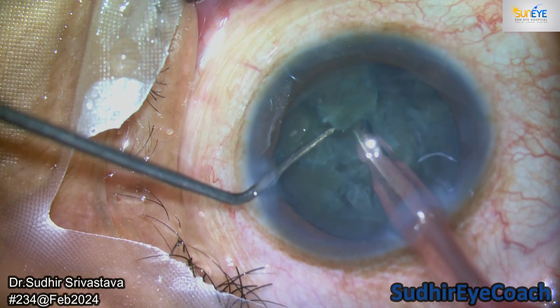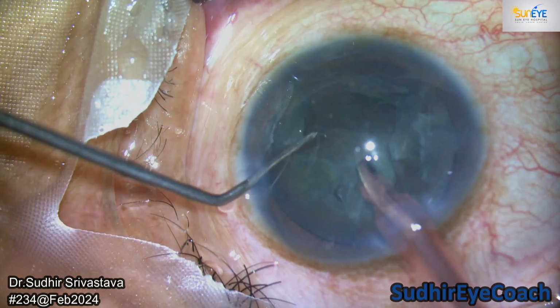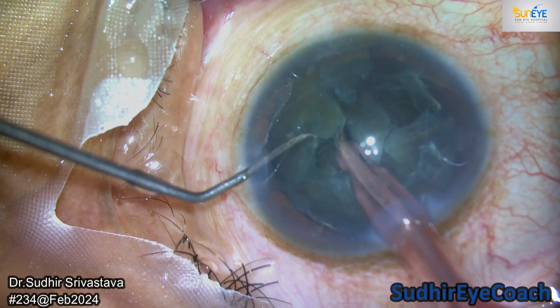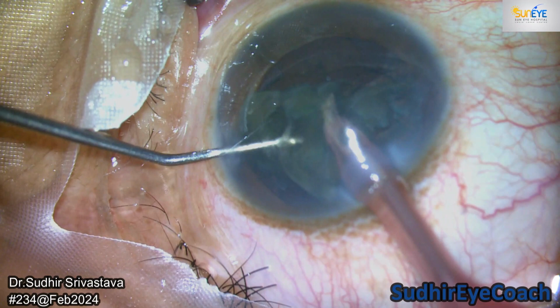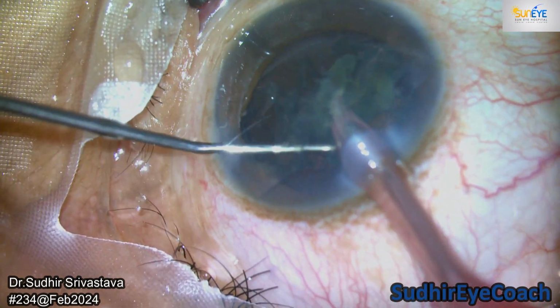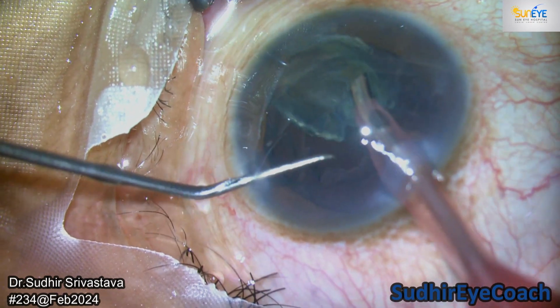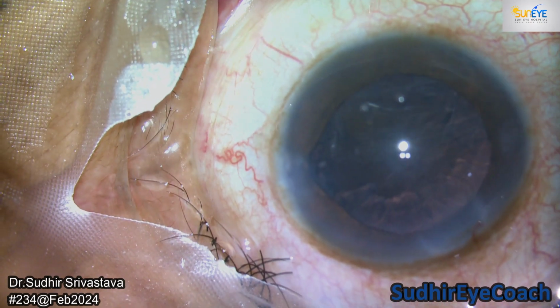You can see in such cases your patience is very important, and so for any experienced surgeon, don't do any procedure in a hurry. Proper visualization is very important. Keep your nerves under control and continue, and always have a look at the cornea and the posterior capsular movement.